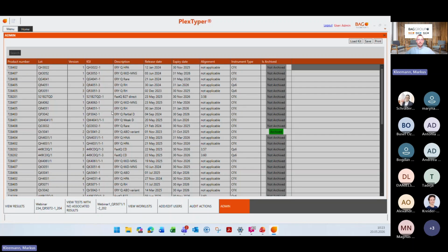The lot number of this kit file is product specific. Whenever you buy a new kit, on this kit there is written its own kit number, the lot number, and this has to be the same as for the kit file you download on our website.